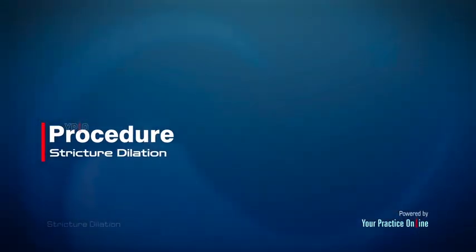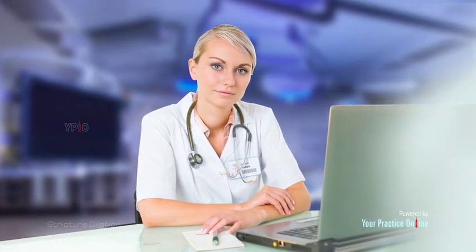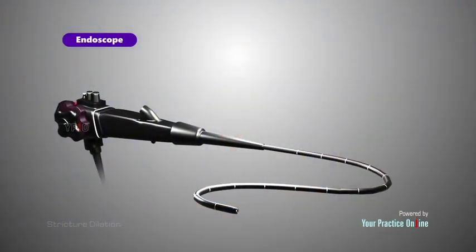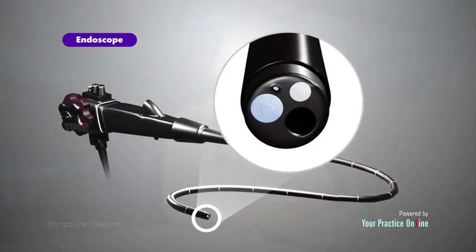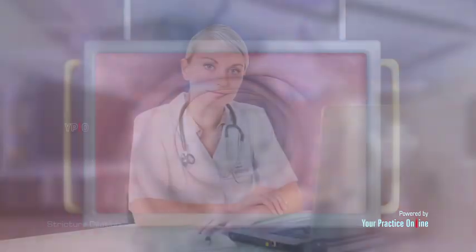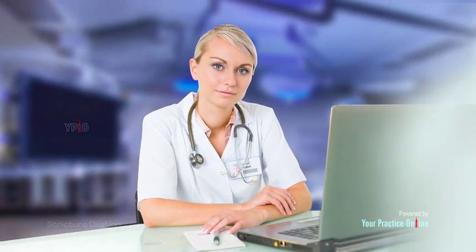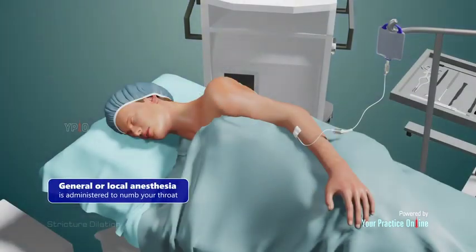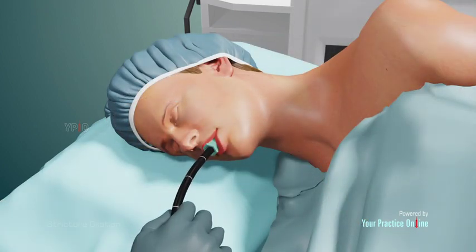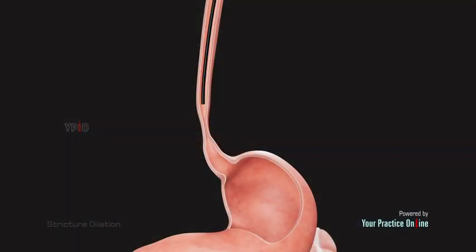Procedure. Stricture dilation is most commonly performed using an endoscopic technique. An endoscope is a long, thin, flexible tube with a camera and light source at the end. Images from the camera are transmitted to a large monitor for your physician to view the inside of your esophagus. In general, the procedure involves the following steps. General or local anesthesia is administered to numb your throat. You may also be given sedation medication to keep you relaxed. Your physician then inserts an endoscope through your mouth into the esophagus.